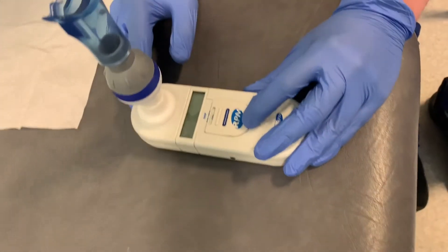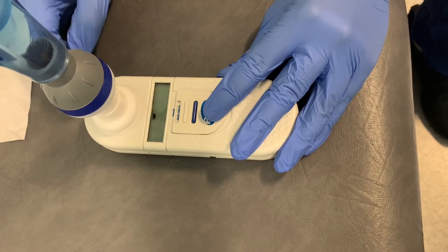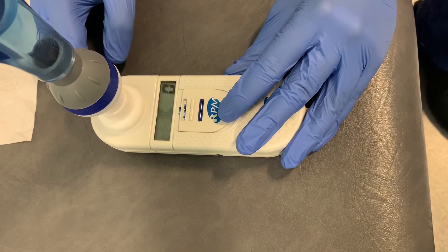To turn the device on, slide it up to MIP and MEP. When the device beeps, it's ready for a measurement.